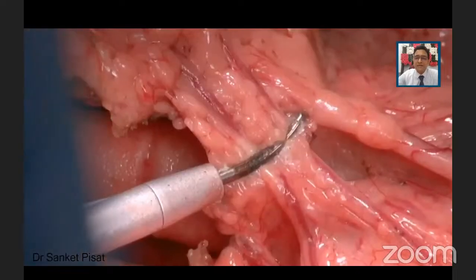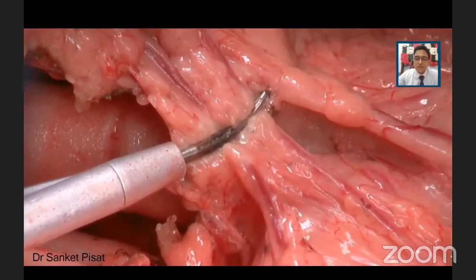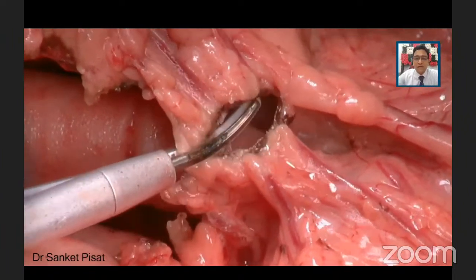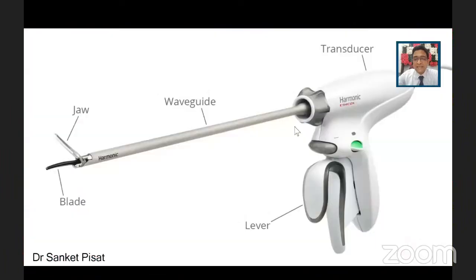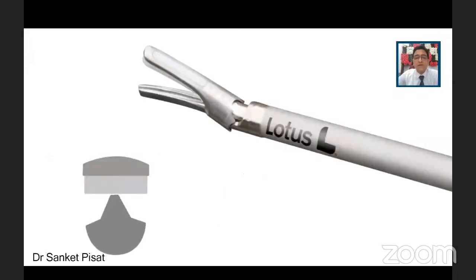The jaw is padded with a white coating so as to offer a good hold to the tissue. So you can see that when the tissue is held and activated, it not only cuts but also seals the edges of the tissue. We are going to look at that. Also, if played in very slow motion, you can see that the tip of the blade has longitudinal vibration, and in some brands there is a torsional vibration as well.